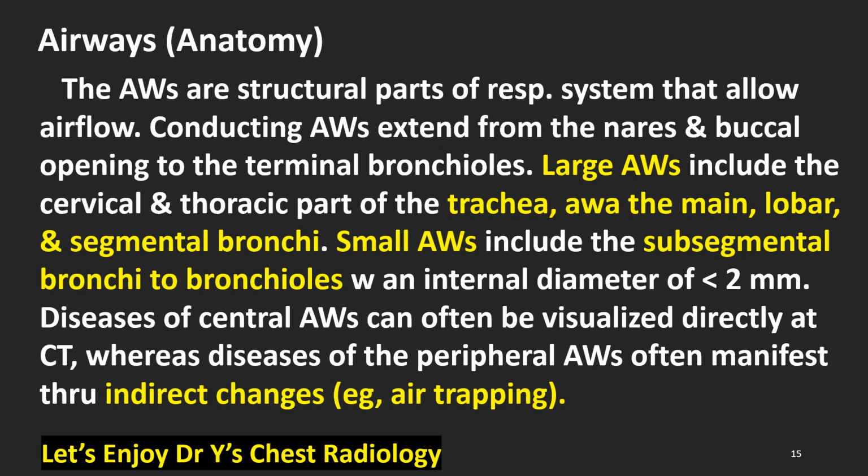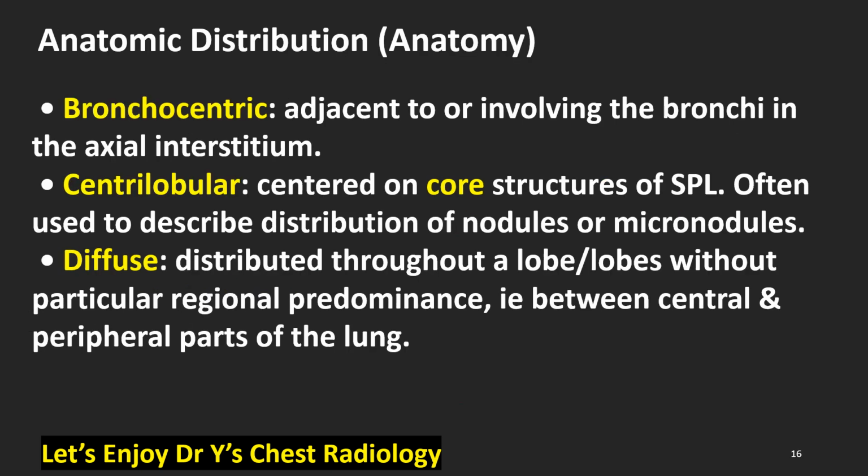Diseases of central airways can often be visualized directly at CT, whereas diseases of the peripheral airways often manifest through indirect changes, for example, air trapping. Anatomic distribution, anatomy, bronchocentric, adjacent to or involved in bronchi and the axial interstitium.